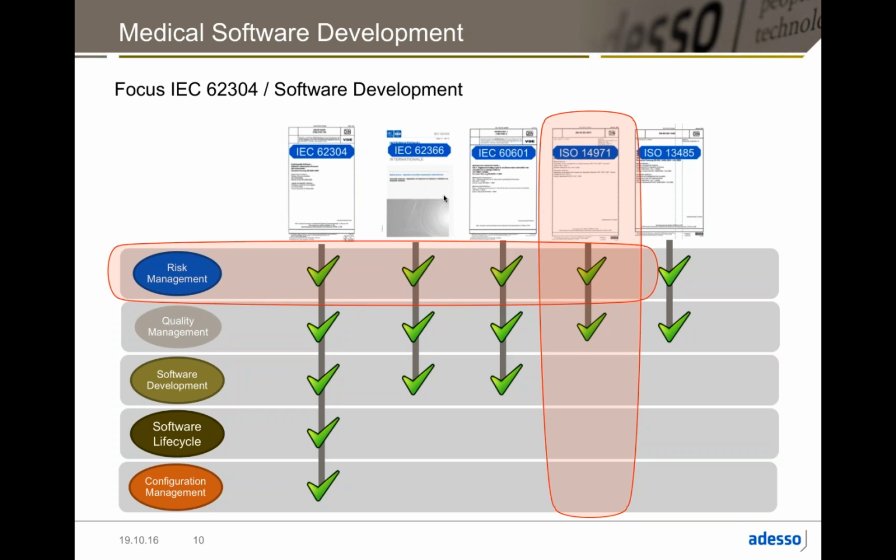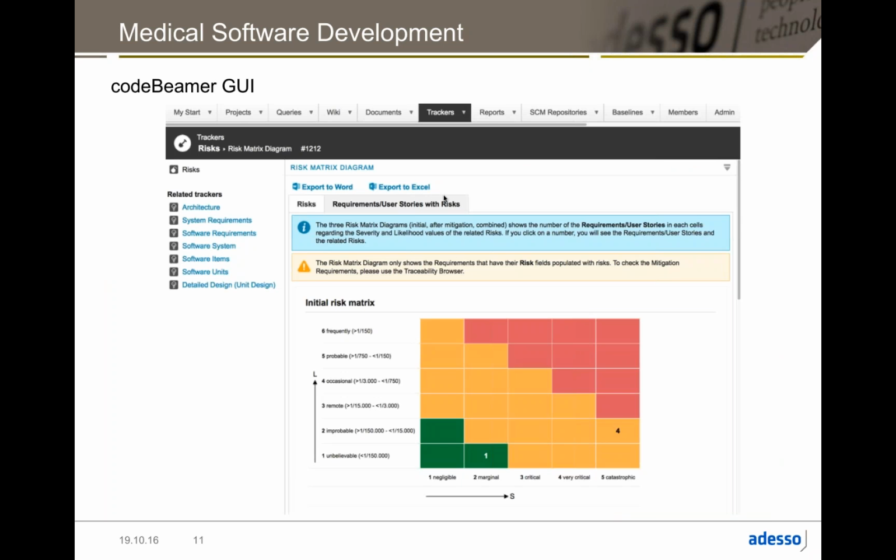If you are doing medical development, you also have to do some kind of risk management and evaluate risk resulting from different requirements. Risks are, for example, displaying the wrong values or not meeting your performance requirements.